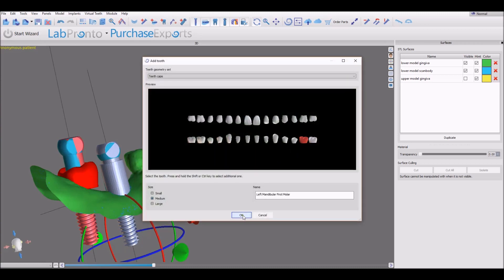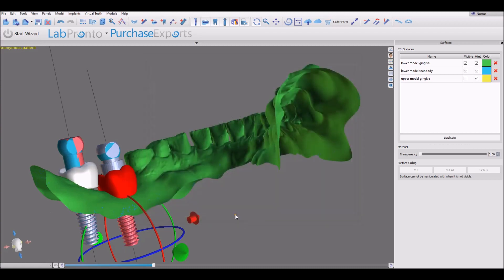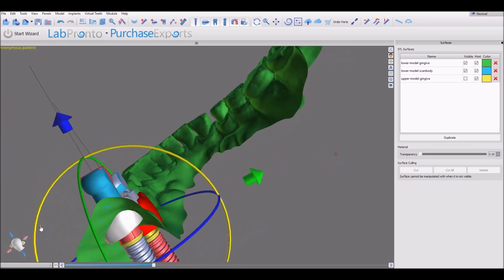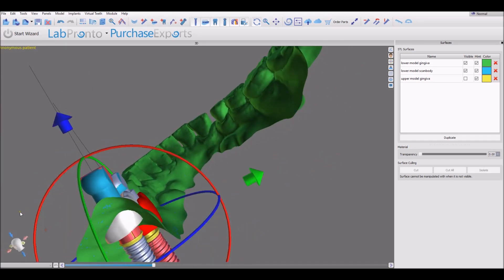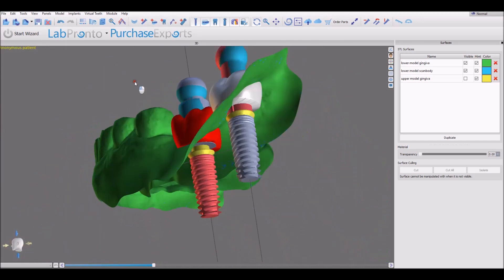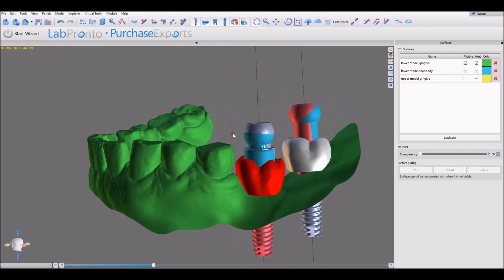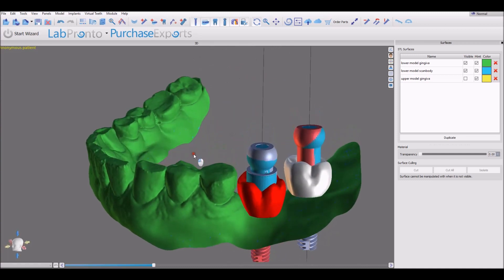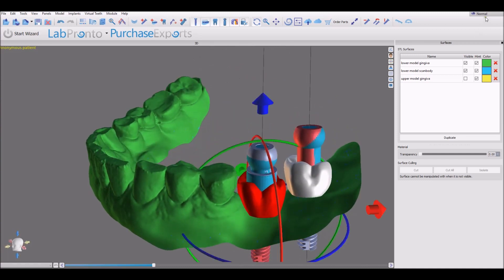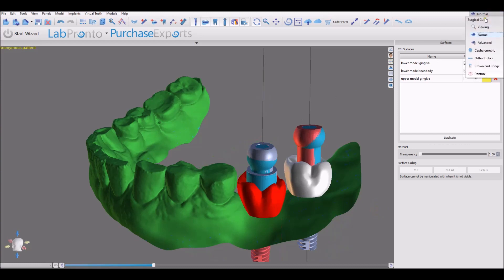So now we've added in our scan bodies, our implants, abutments, and our teeth. We're going to switch over to the CAD module to continue creating the crowns by clicking Crown and Bridge.